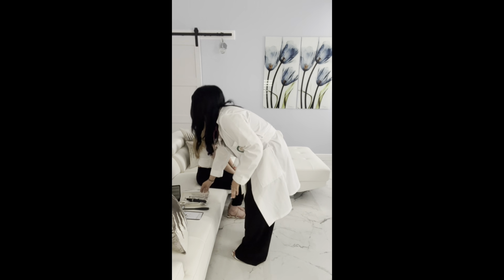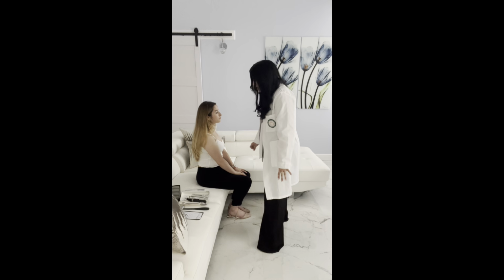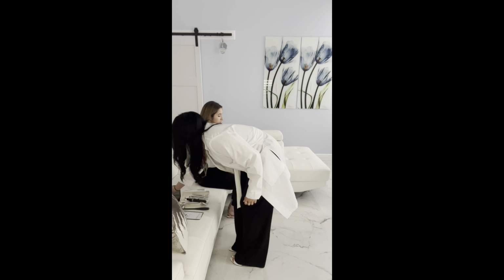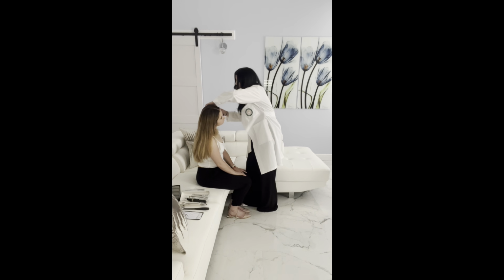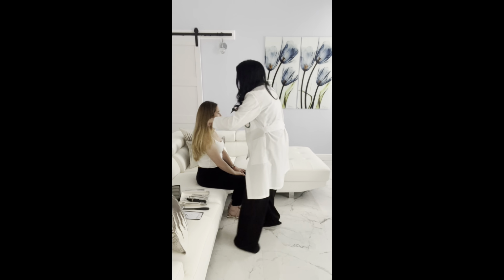All right. The next thing that we're going to do is an otoscopic exam. And I'm just going to go ahead and take a look at your ears. All right. Okay, perfect. I'm going to take a look at the other one.